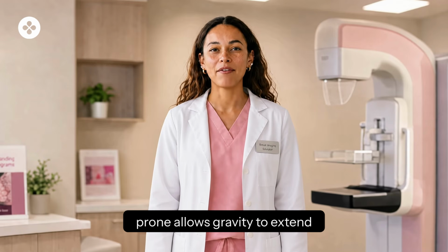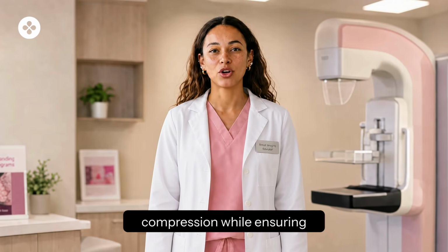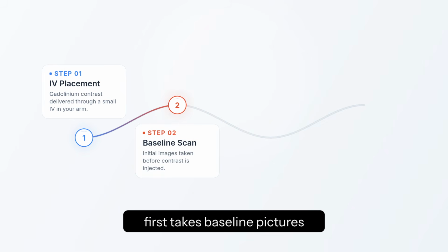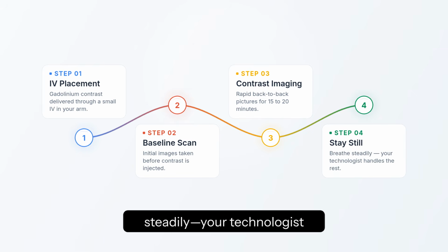Lying prone allows gravity to extend the tissue away from the chest wall, eliminating painful compression while ensuring complete visualization of deep tissue structures. Breast MRI exams rely on a contrast agent called gadolinium, administered through a small IV in your arm. The technologist first takes baseline pictures before contrast is injected. Once contrast flows into your bloodstream, the scanner takes rapid back-to-back pictures for about 15 to 20 minutes. All you need to do is lie still and breathe steadily. Your technologist handles all scan timing from the control room.